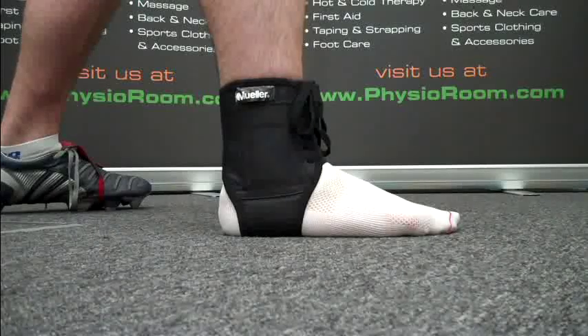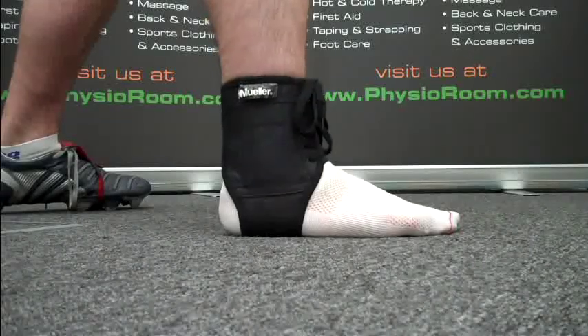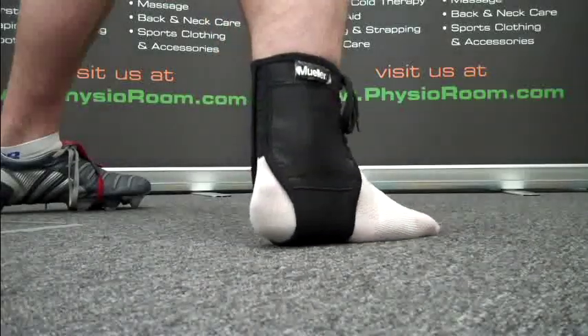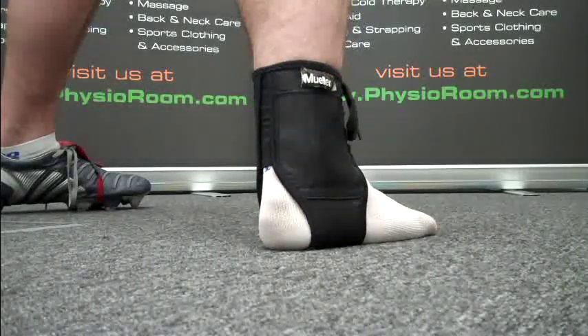The brace is high cut with a narrow bottom to ensure mobility is not restricted. The high back cut allows for a better fit in football shoes but is also suitable for gymnastics, racquet sports, running and martial arts.